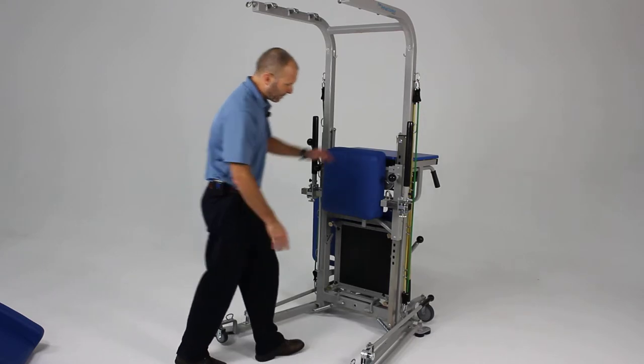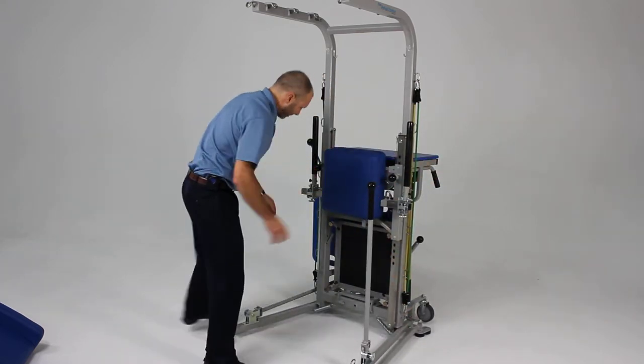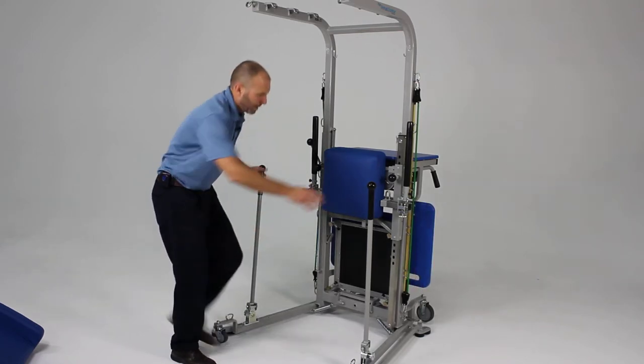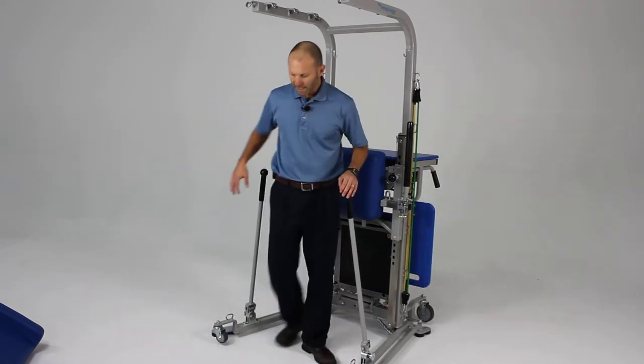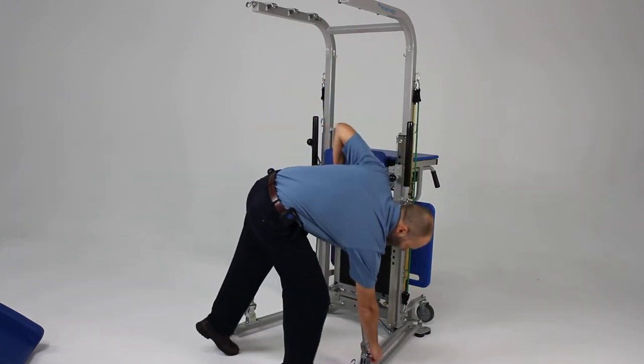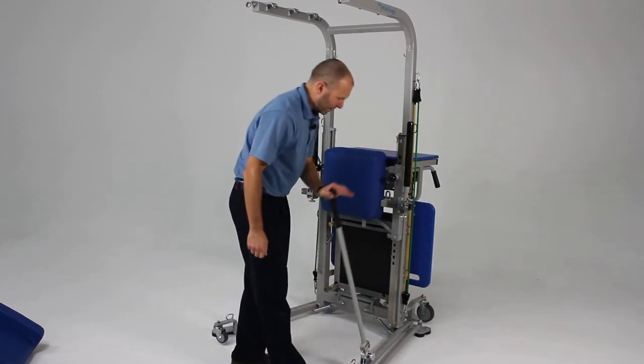We have some upper extremity activity poles. These poles can come up into place and can be used for numerous activities, sitting or standing. They have a resistance knob so the amount of resistance they provide can be adjusted for the patient.